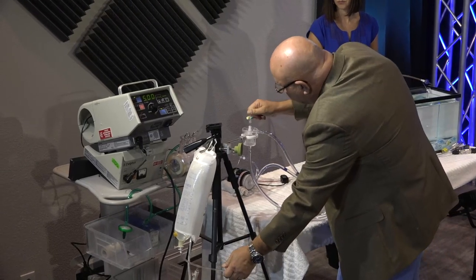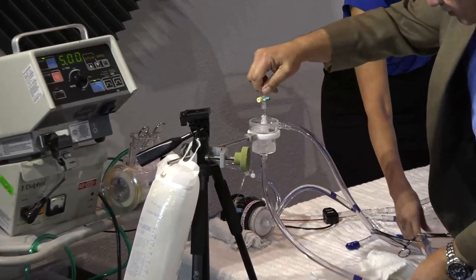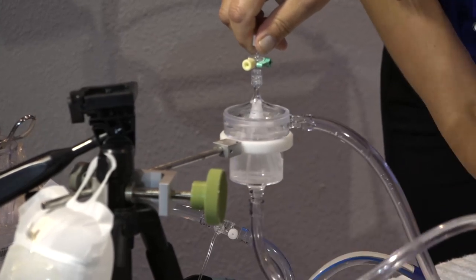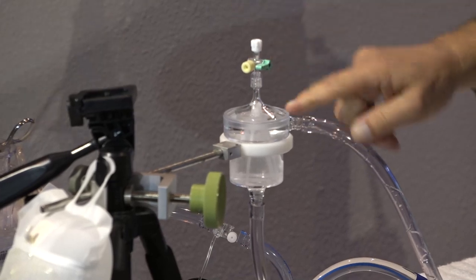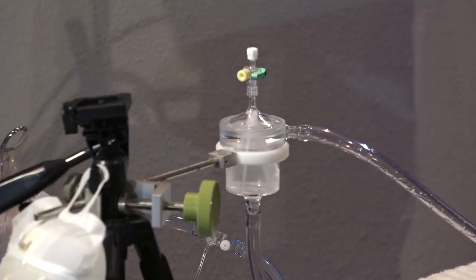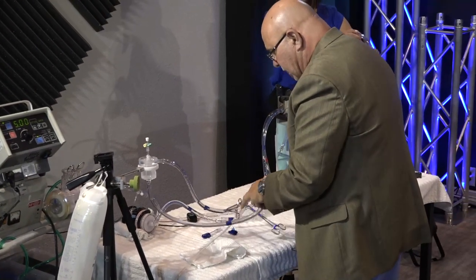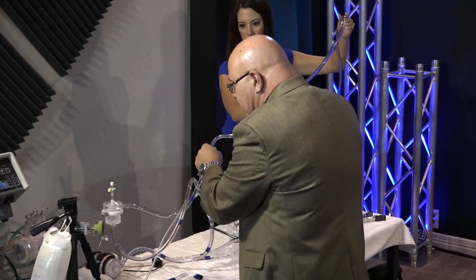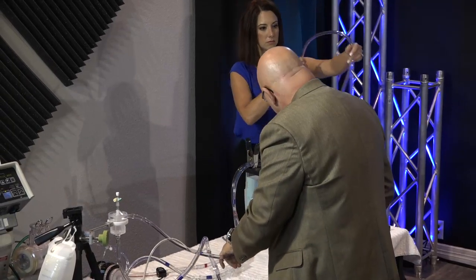Open this up, and I'm going to let this fill and try to get as much of the air out as you can. And thank you. Okay. And then I'll clamp that when we get that little meniscus right here. All right. Fast. So now I'm going to flush this towards Stephanie, and she's going to let it just prime into the bucket and hold it up to allow for air to be evacuated. They would do this at the field.